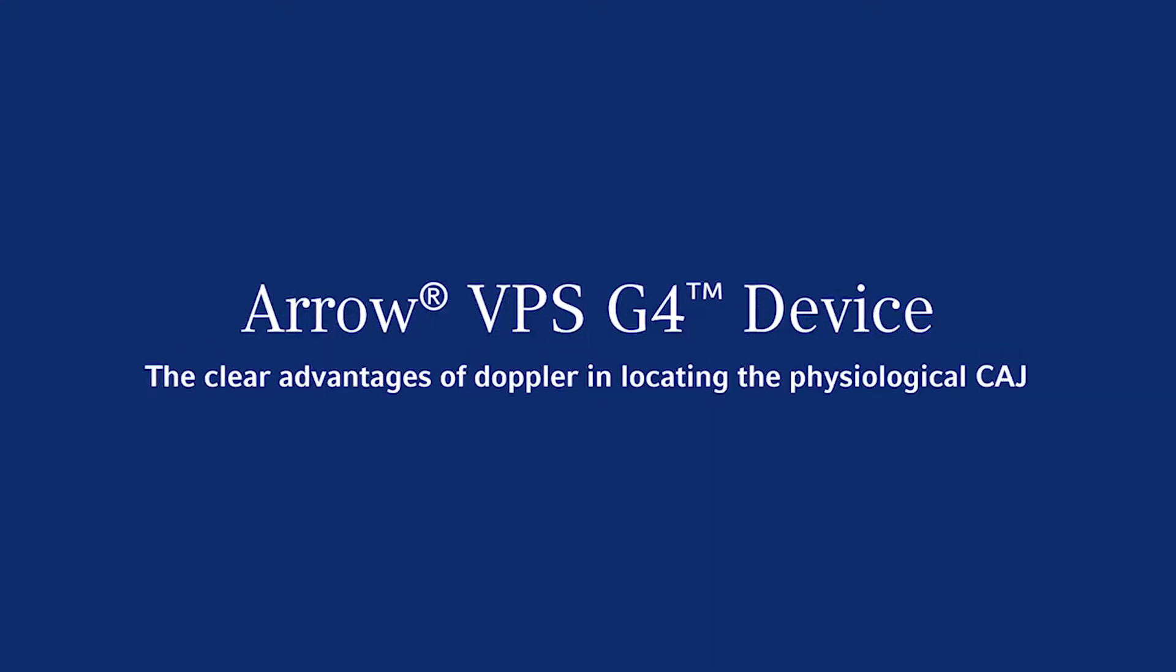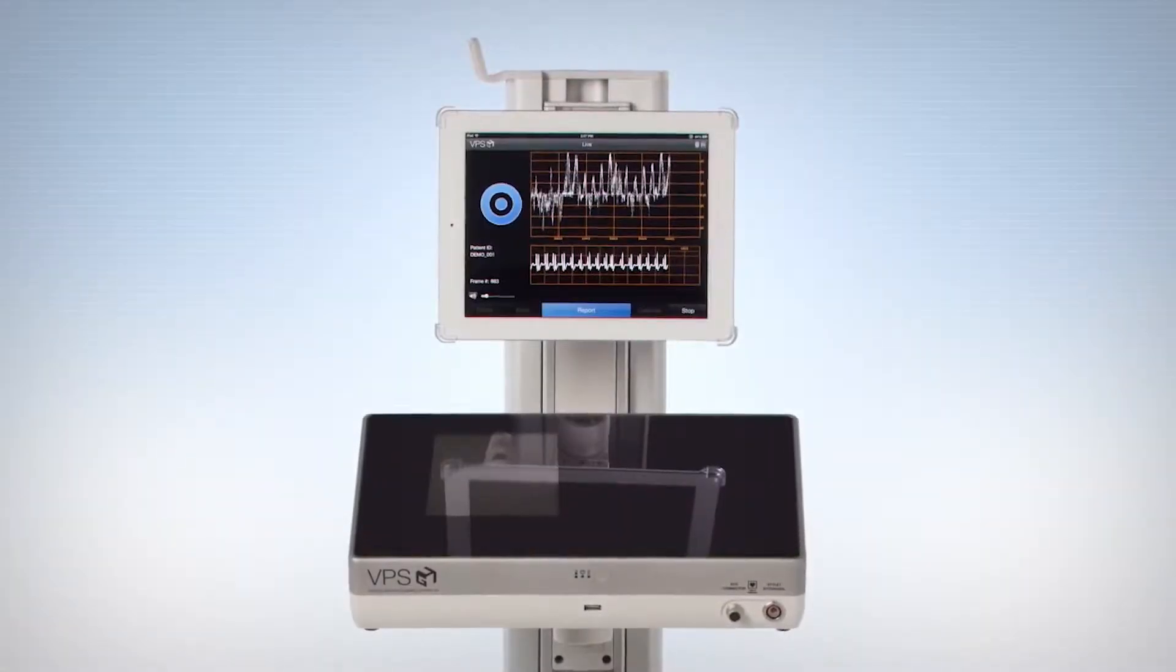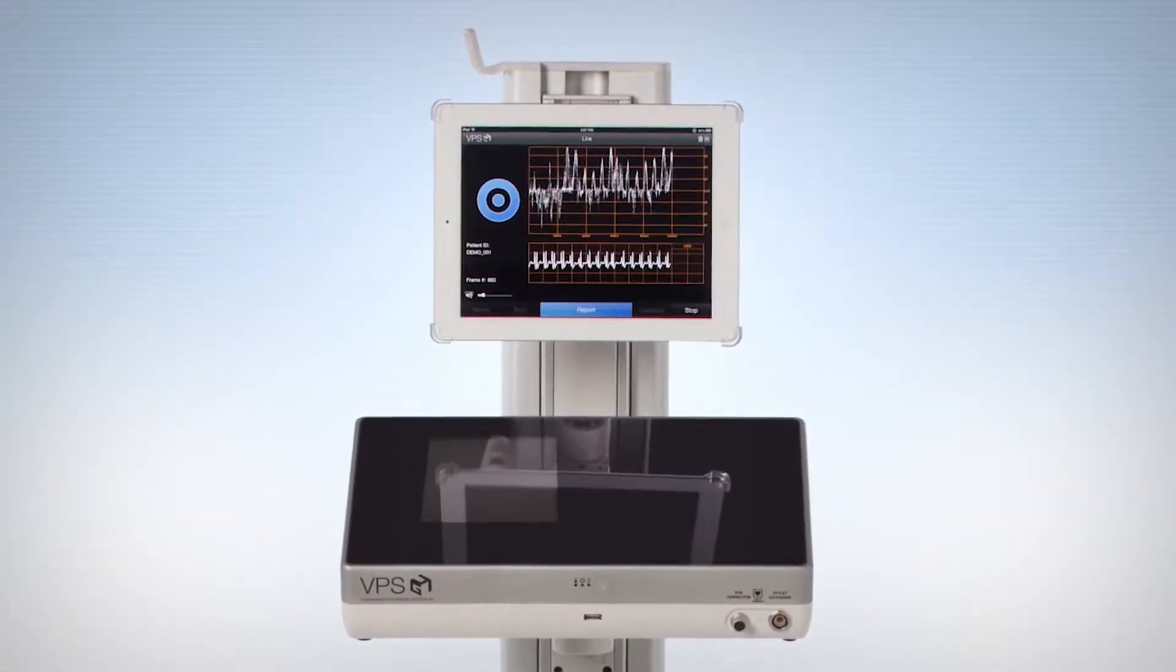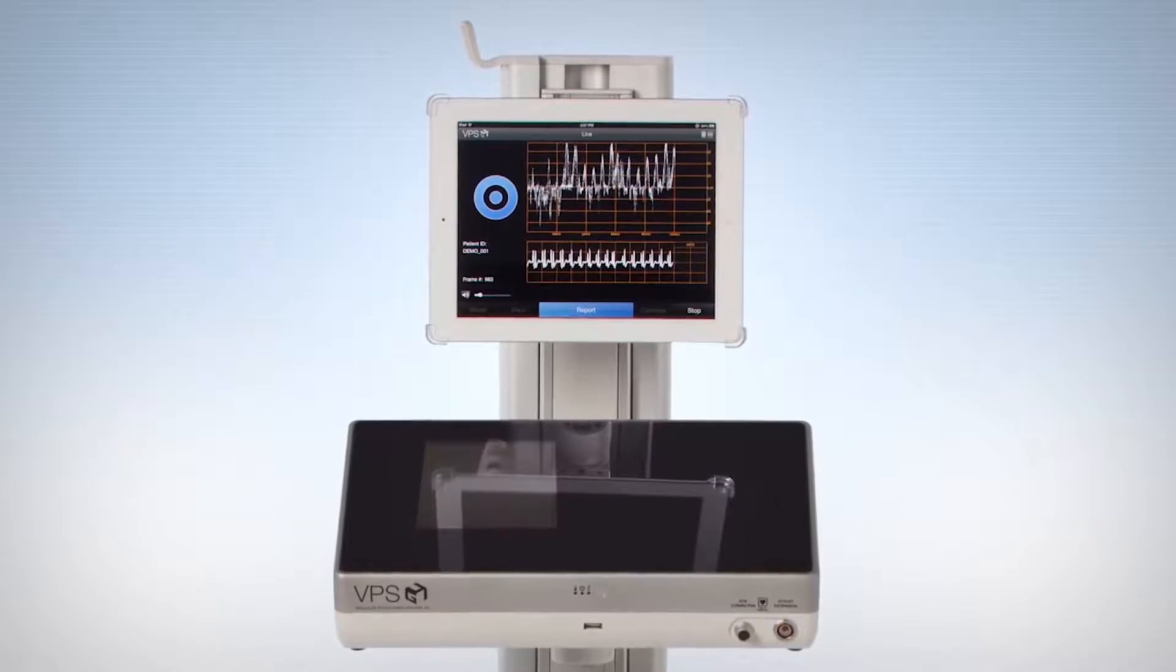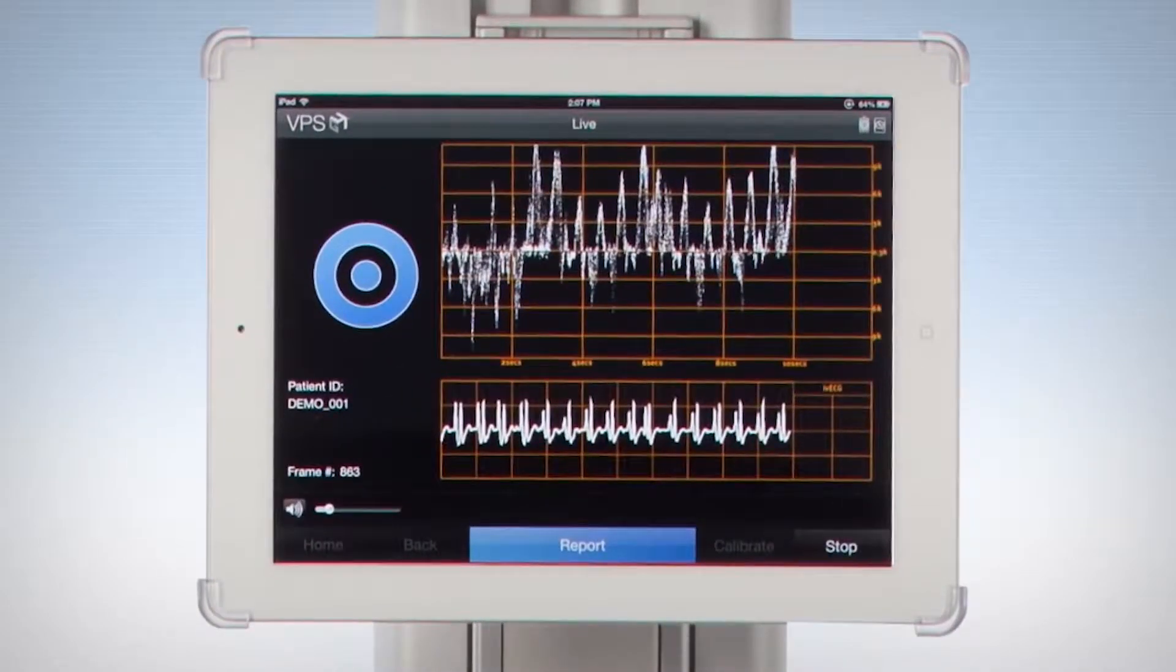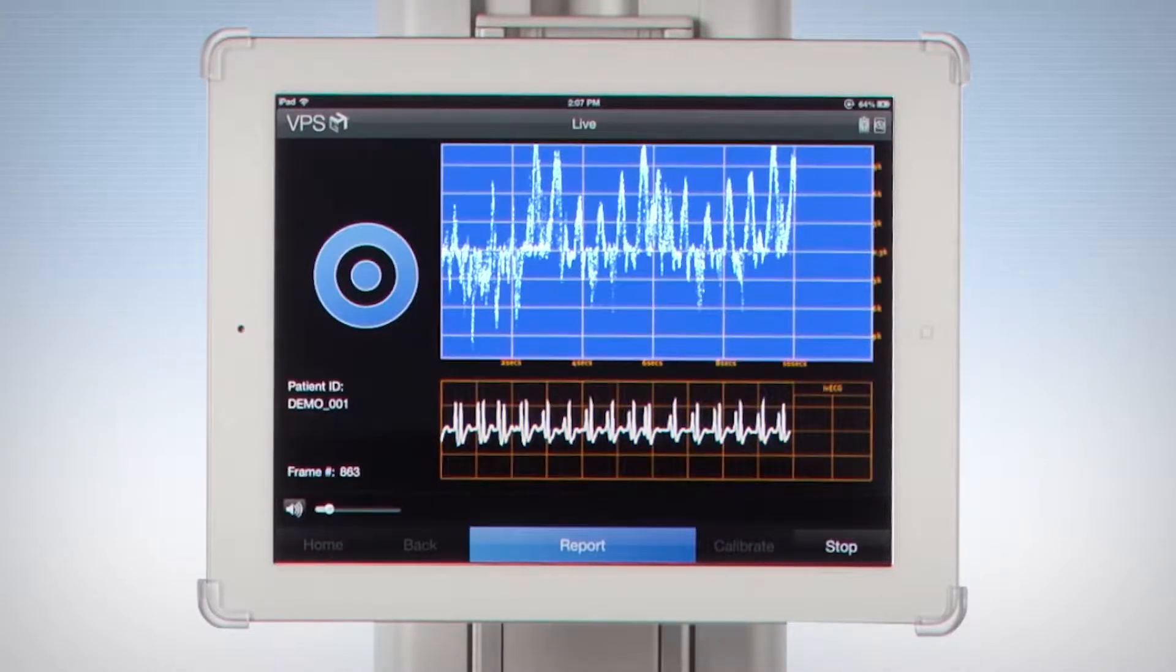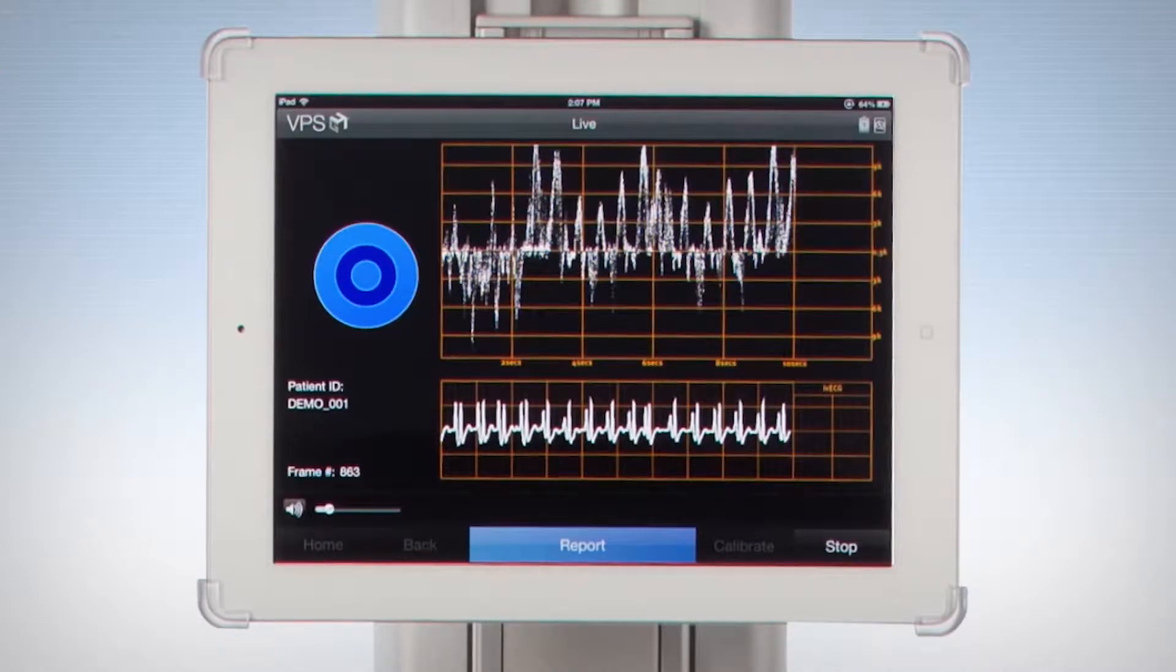With the Arrow VPS G4 Vascular Positioning System, clinicians have the opportunity to avoid unexpected complications common with central line insertion. The Arrow VPS G4 device is intended for use in the insertion of central venous access catheters in adult patients. This unique product innovation utilizes a three vector technology which includes intravascular ECG, Doppler ultrasound, and a physiologic algorithm.